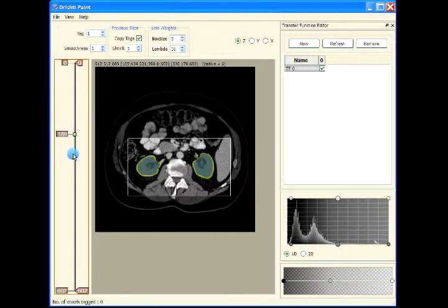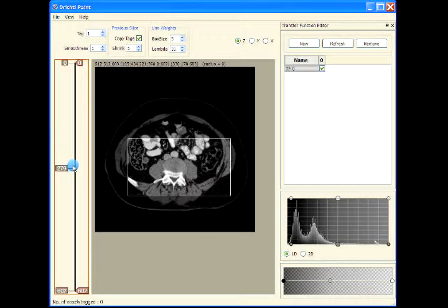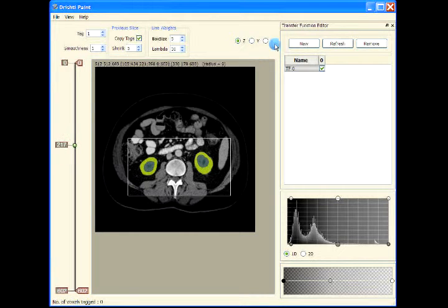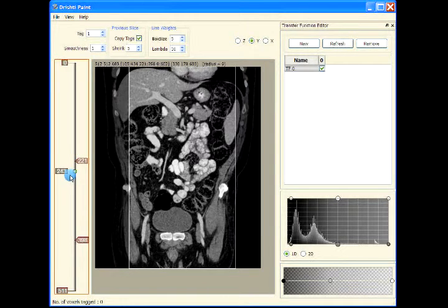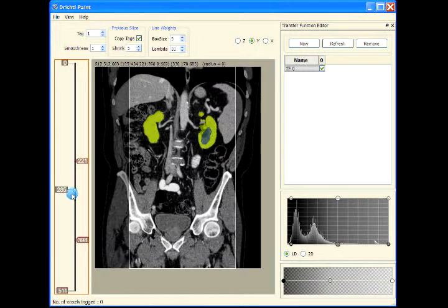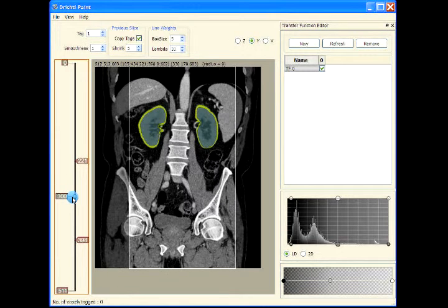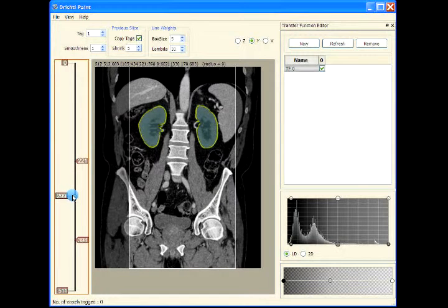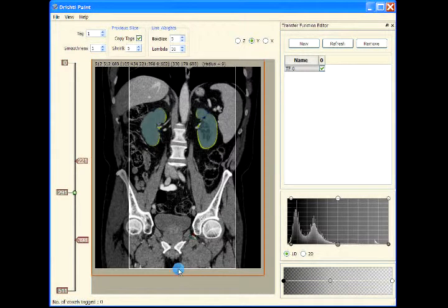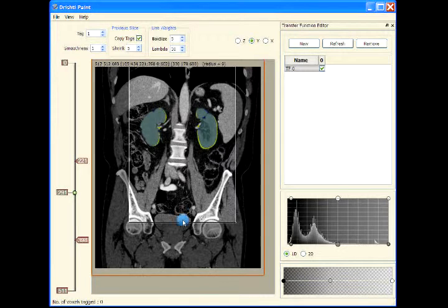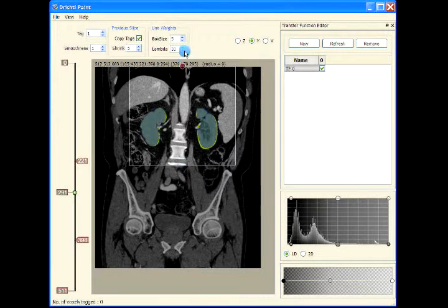Okay, so these are our kidneys. I'm using Alt and the left mouse button to restrict the box.